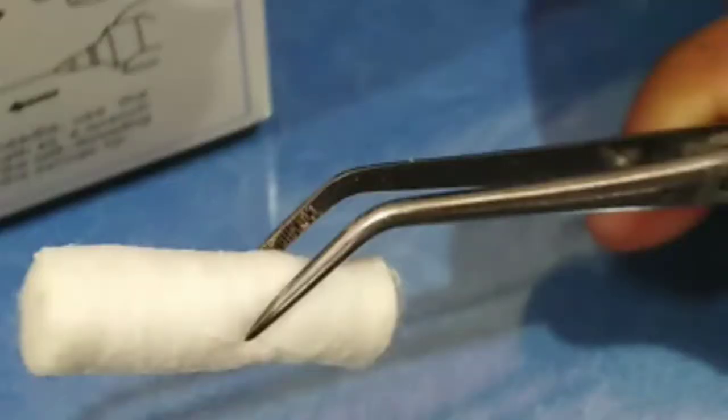Point number 4 is aspiration. Must remember this point, and not only for the IANB. Whenever you insert the needle, before depositing the solution, you have to aspirate first to ensure that the needle is not in a blood vessel. If aspiration is positive, don't deposit the solution. If aspiration is negative, deposit only. This is very important.